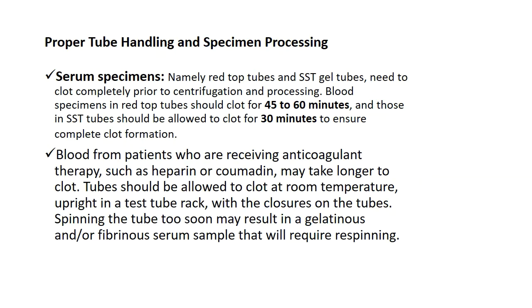See, proper tube handling and specimen processing. It is sometimes seen, due to hurry at the collection center, that they never wait after the collection of the blood. That should be settled. For the red top tubes, give adequate time for clot formation: 45 to 60 minutes for the serum separator gel tube, minimum 30 minutes for clot formation. But before clot formation is complete, they centrifuge, and it leads to hemolysis. So that is a very important thing. Only after the clot has formed should you centrifuge and then process.